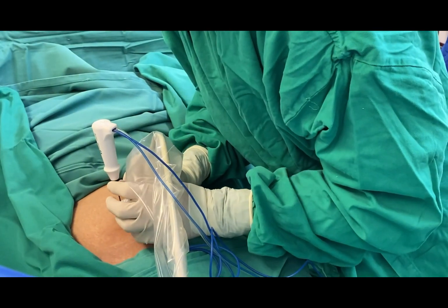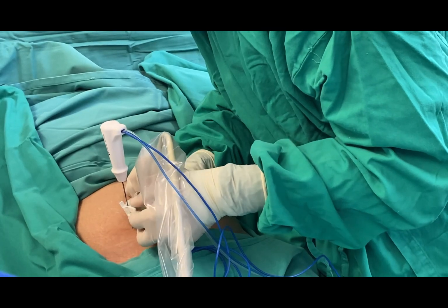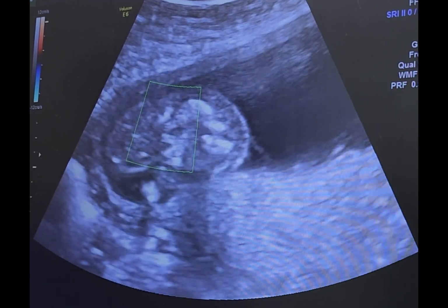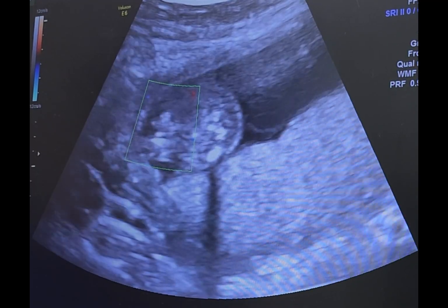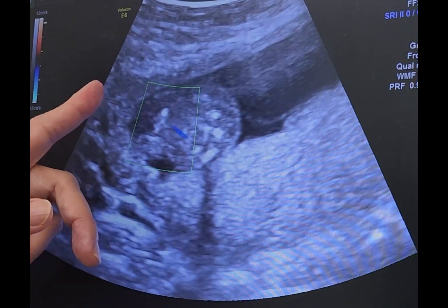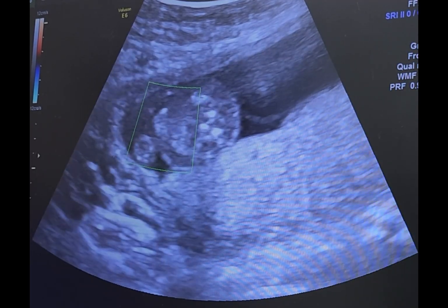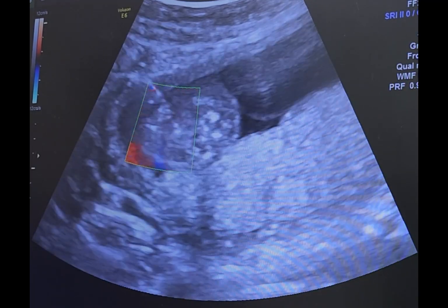My movement here was restricted by the biopsy guide. Therefore, we removed it to allow a greater range of movement. With the needle still sitting in the subcutaneous tissue, we re-angle it to the target where the cord inserts.